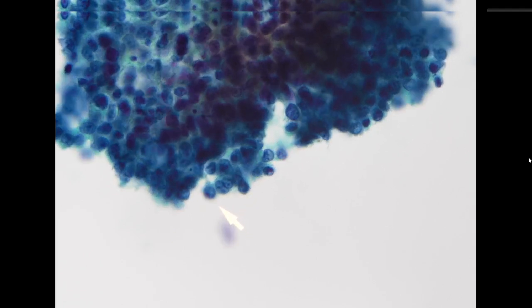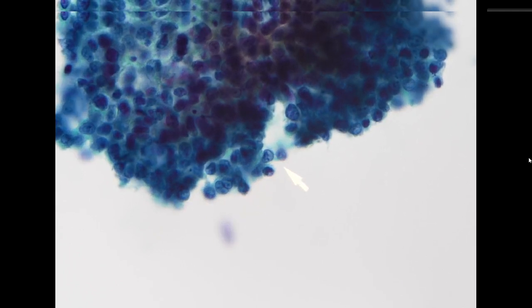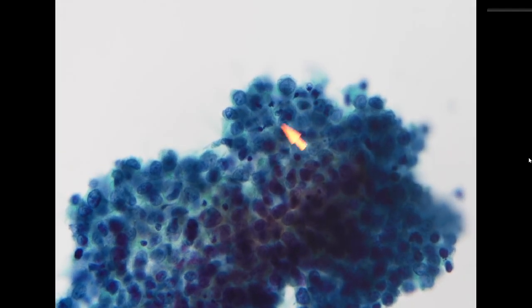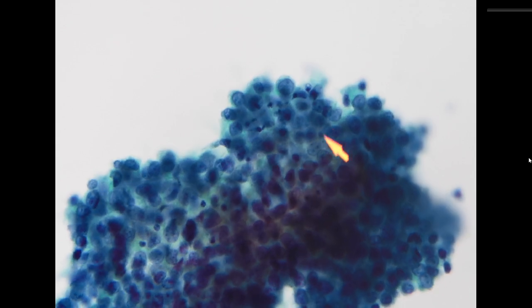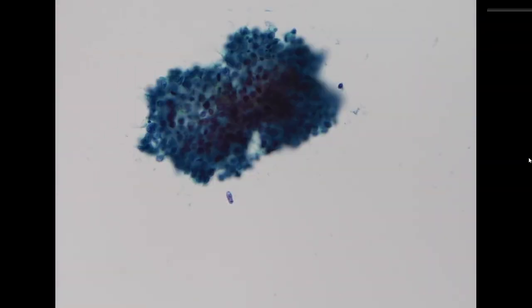I think for this fragment, we do appreciate that the majority of the cells show hyperchromatic nuclei, some with a coarsely granular chromatin pattern, and the NC ratio of these cells is indeed increased. It's very high. Additionally, there seems to be some individual cell karyorrhexis pattern within the fragment. So I think at least we need to call this suspicious for high-grade urothelial carcinoma.